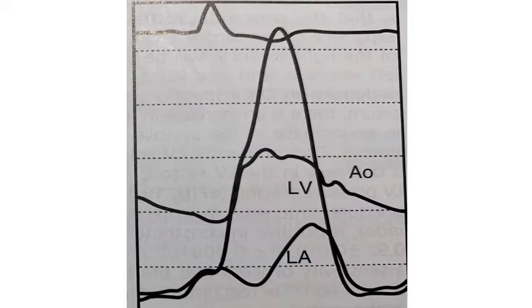What do you mean by spike and dome? I mean HOCM, sir, hypertrophic, subaortic level, sir. You cannot use the word subaortic level. Subaortic can be dynamic as well as fixed. Sir, I mean HOCM, dynamic obstruction of the LV. Okay, right, yes. See, Saroj, you have to look here. When the pressure in the LV rises, what happens to the aortic pressure? Yes, sir.